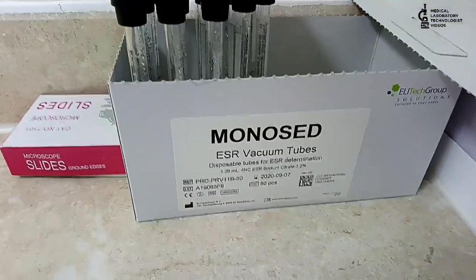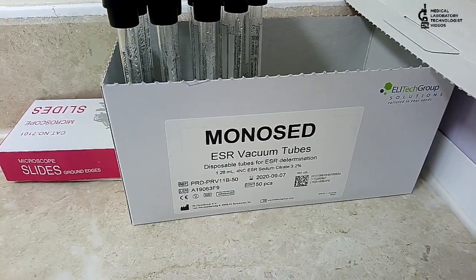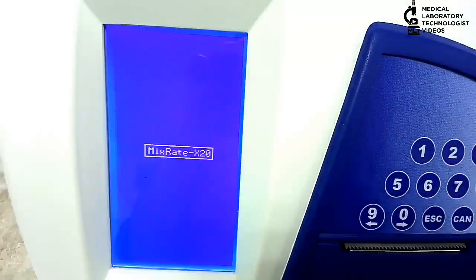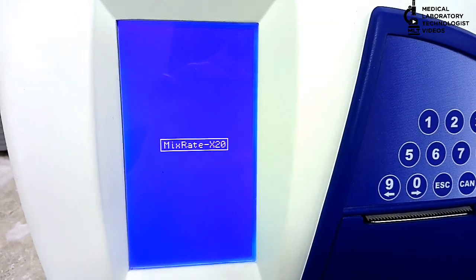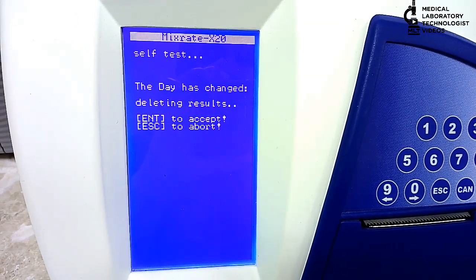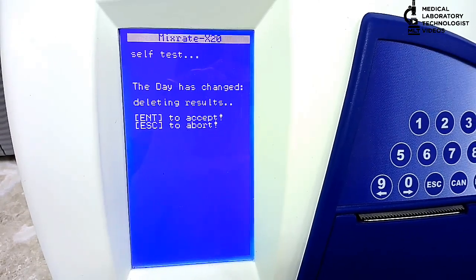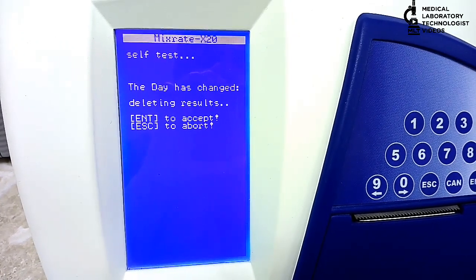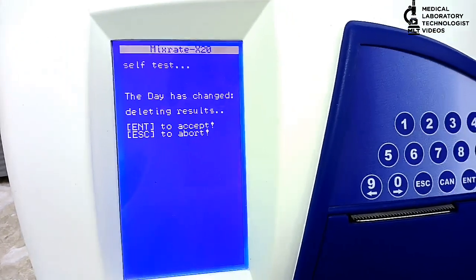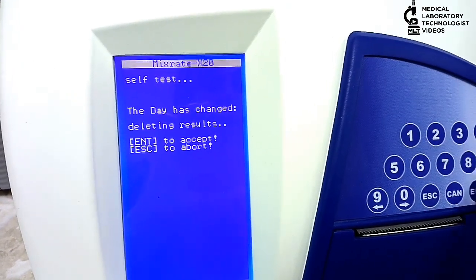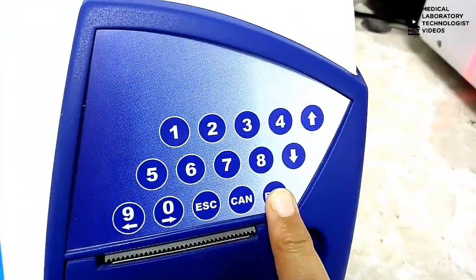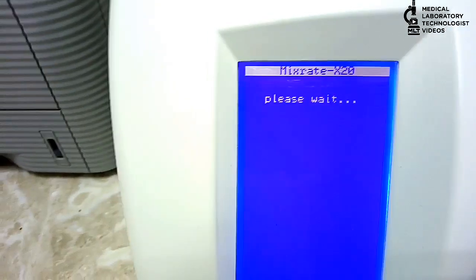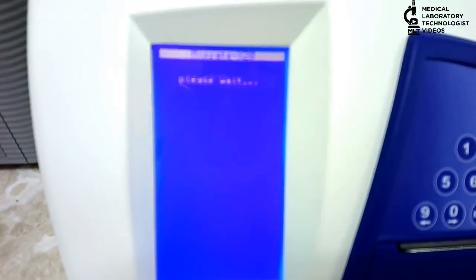Now I turn on the machine, and the screen will display a self-test. If you want to delete previous results, you will choose Enter, and if you don't want, then choose Escape button. I will click Enter button because I don't want previous results to keep, because otherwise it's difficult to find new results.